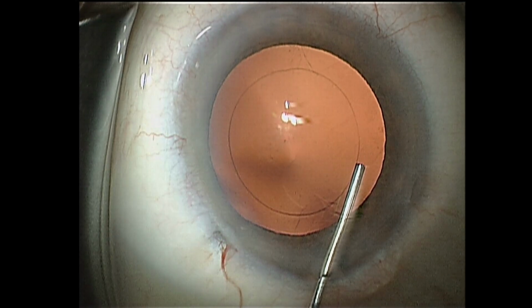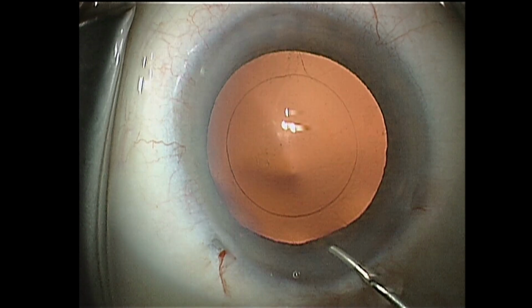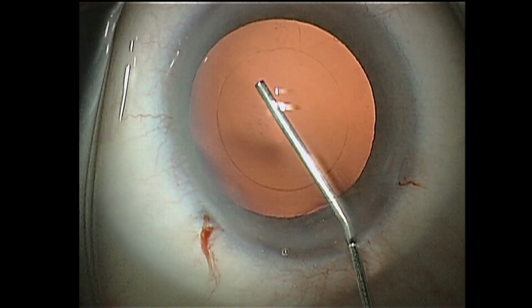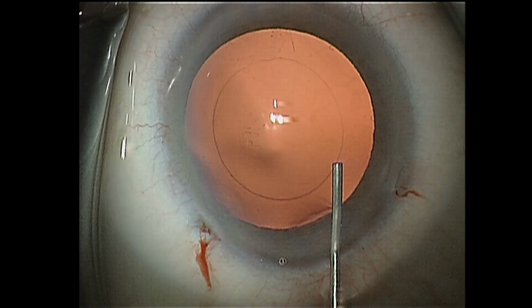Regular Healon is now injected above the anterior capsule leaf in order to bring it down and attach it to the posterior capsule. Then the central posterior capsule is flattened, thus creating a common planar capsule diaphragm.